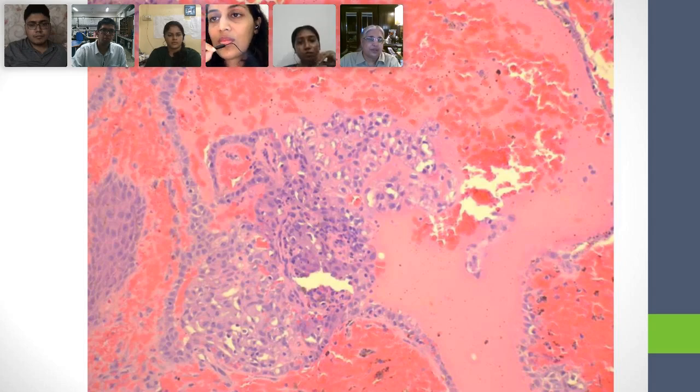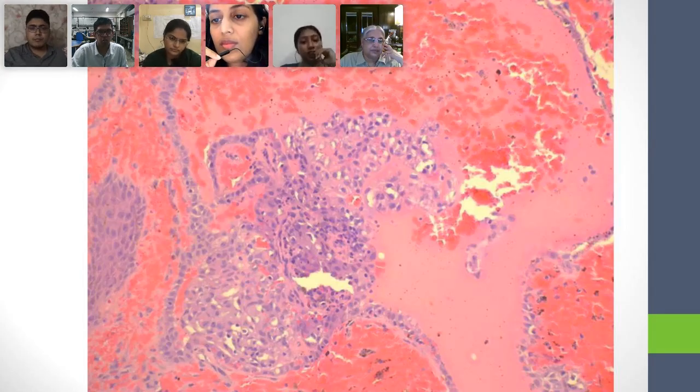All right, come on, Neha. Can you please describe this? What do the cells look like? Ma'am, in the lower portion it looks very solid, and then there is a vague glandular pattern of structures arising from it. Okay, it has changed now. All right, so you had a lag.